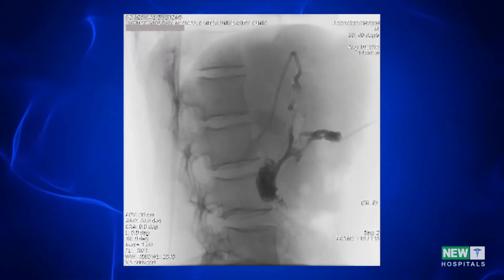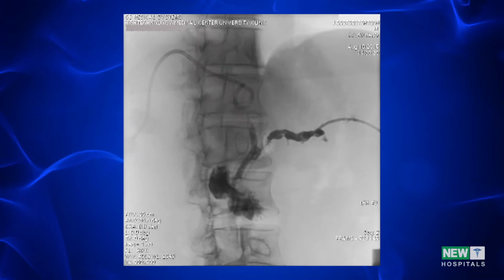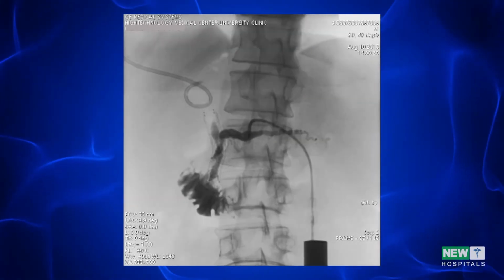Our idea, now clinically proven, is very simple and can be described as follows. The basic procedure is an imaging-guided percutaneous drainage of the dilated pancreatic duct. It means catheter placement in it, which allows for constant decompression. It is performed without any surgical incision and helps to eliminate or alleviate all previously mentioned problems associated with duct dilatation. Second-line procedures are performed a few days after drainage.